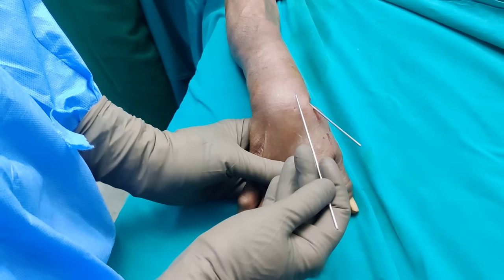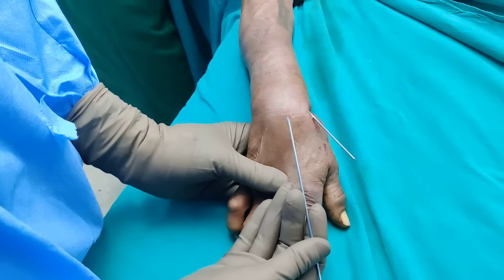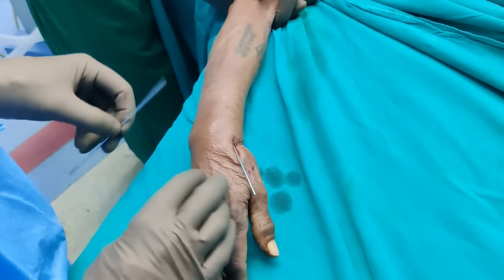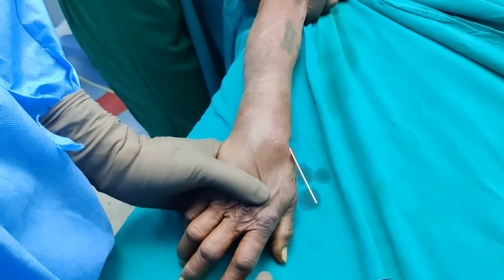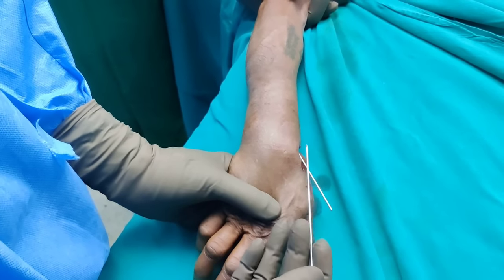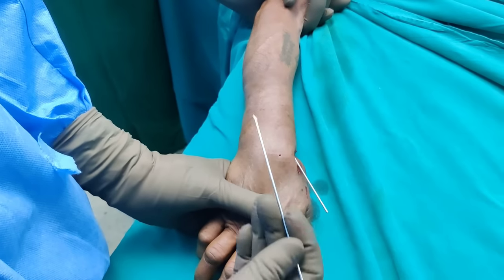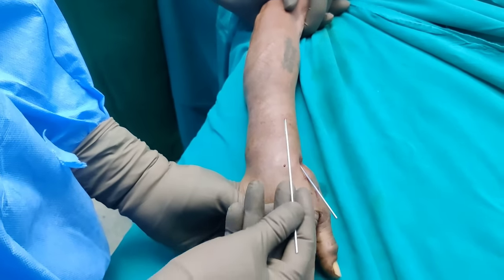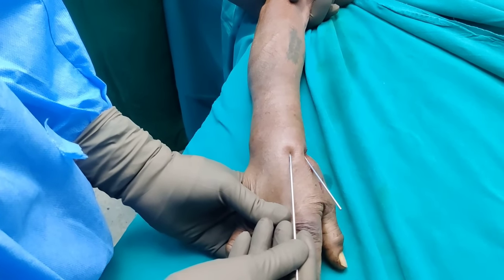I have been practicing in India for almost six years and I have seen wires of different shapes and configurations — wires going from volar to dorsal, three wires, multiple configurations — and a lot of times I do not agree with what I see. My first wire will always be the radial styloid wire. Then depending on your philosophy — if you follow Kapandji you go intrafocal at the fracture site; I have tried it and it does not make a huge difference provided you do the job properly. For the second wire, I take an AP ensuring the wire is in the center of the radius just at the lip of the articular surface.